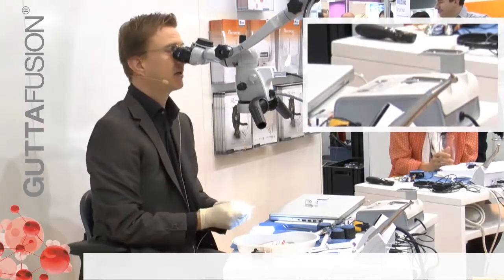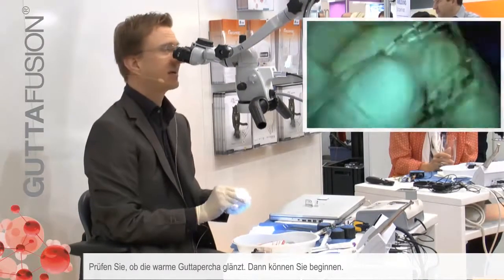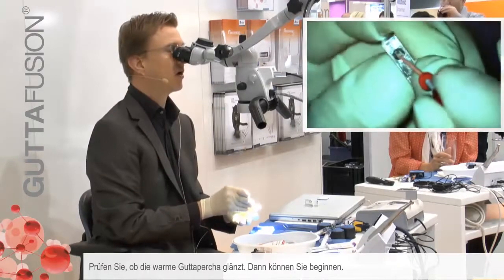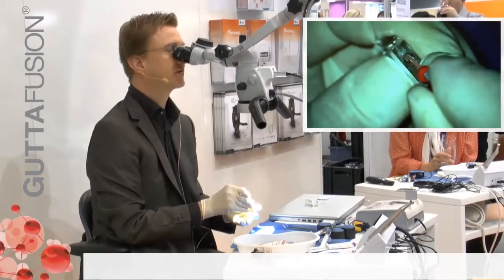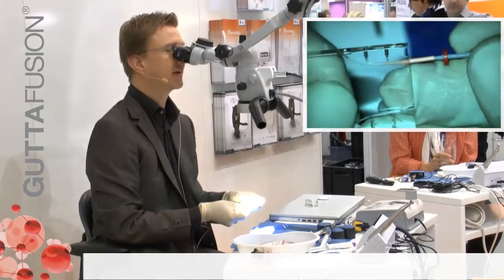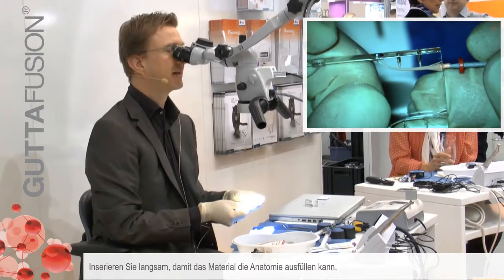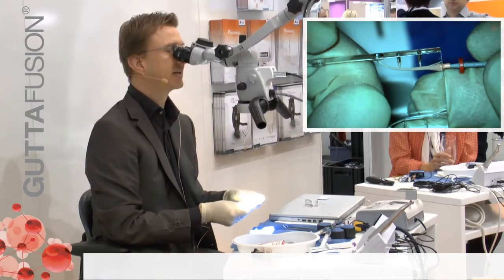Clinically, we look at it and see if it is shiny or not. Yes it is, so I am ready to go. It's important to aim, and then look at that — insert slowly and allow the material to actually fill the anatomy that we want.